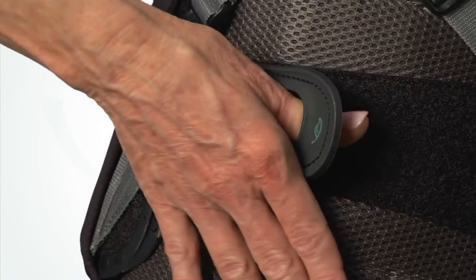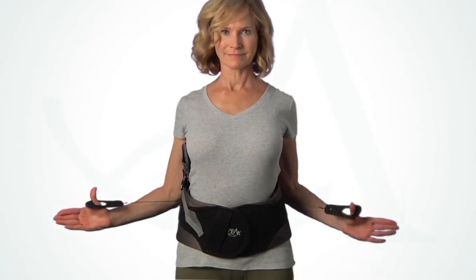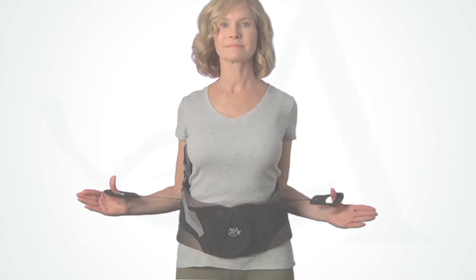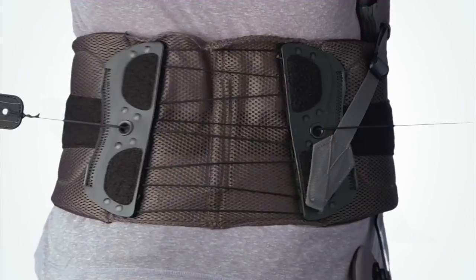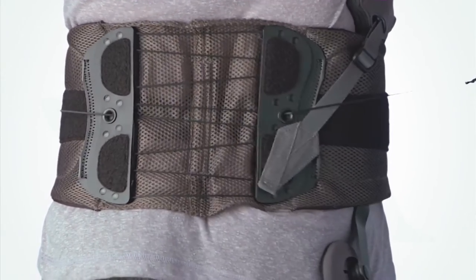To tighten, grasp the pull tabs and pull away from the body. Over-tighten the brace, then loosen it slightly to achieve a supportive but comfortable fit. Be aware that the right pull tab controls the upper compression and the left pull tab controls the lower compression.